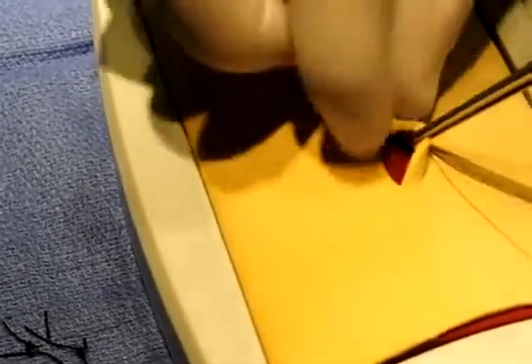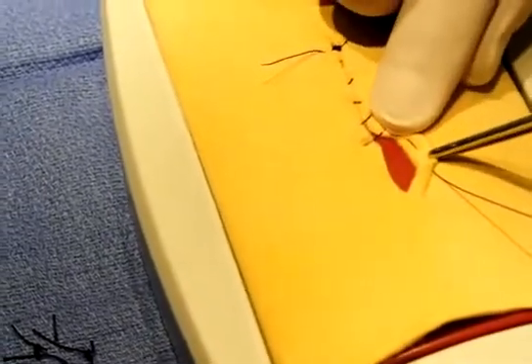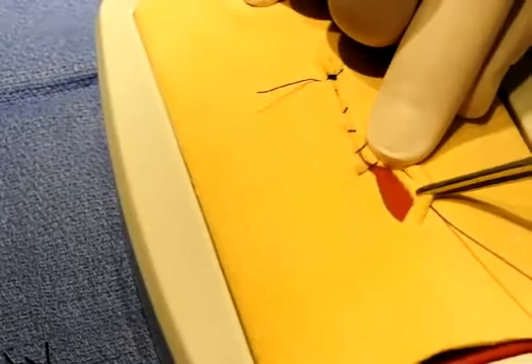Coming here, going all the way through, see, all the way through, and exiting parallel. And this inverts too, see, pulling it inward like that, inverting the edges. You can see how strongly this is inverting. It's wanting to pull that whole thing in. And if we look from the underside, there we can see there's the suture material right there showing in the lumen. So that's the difference between the Cushing and the Connell.